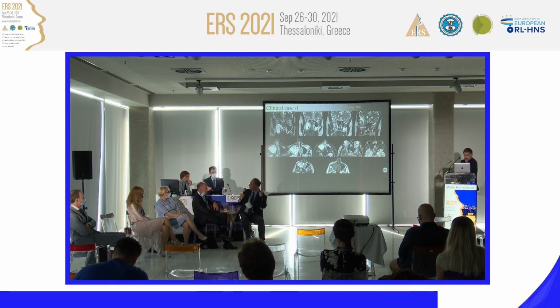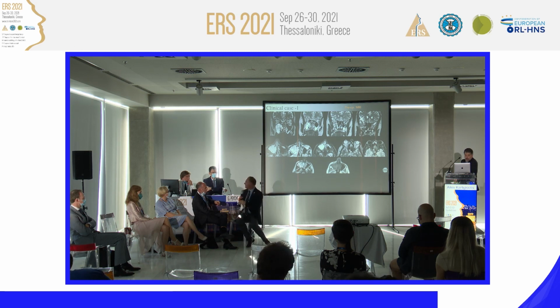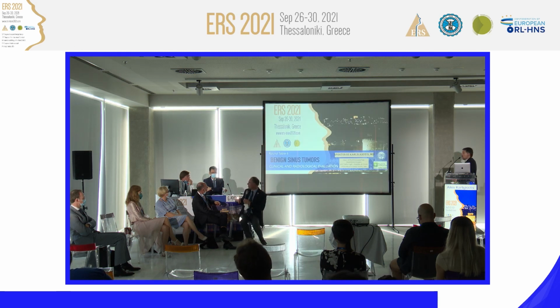Generally, if it's an inverted papilloma or squamous cell carcinoma or any other tumor, just for research purposes, we are trying to get scans of that scene. But during surgery, while we are having the dissection, if we have any question mark, we just turn it on and have a look.